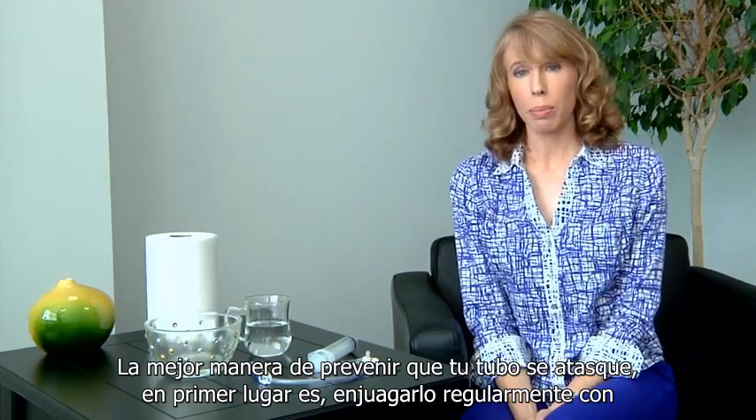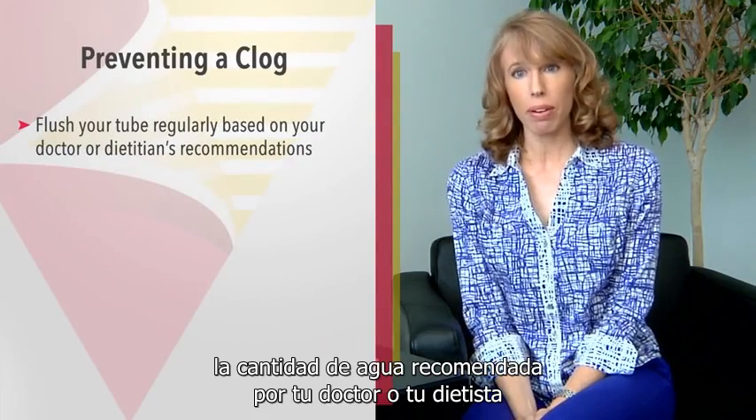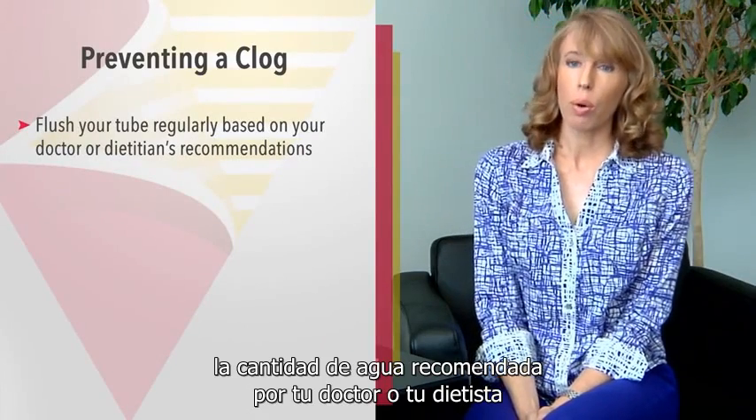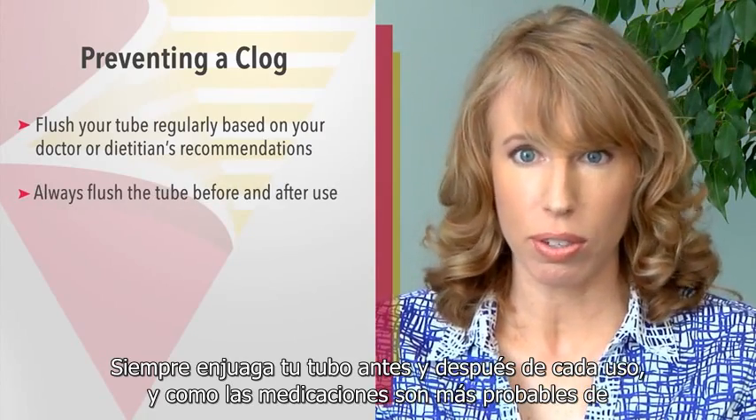The best way to prevent your tube from becoming clogged in the first place is to regularly flush it with the amount of water recommended by your doctor or your dietitian. Always flush your tube before and after every time you use it.